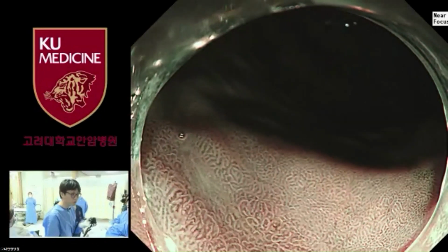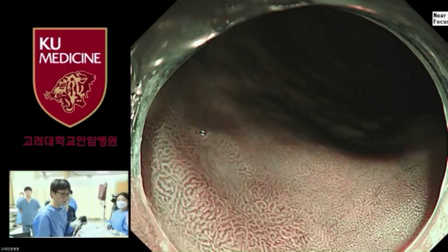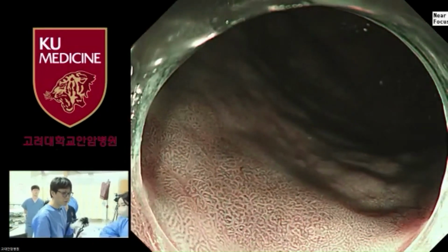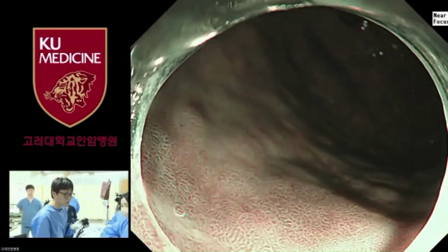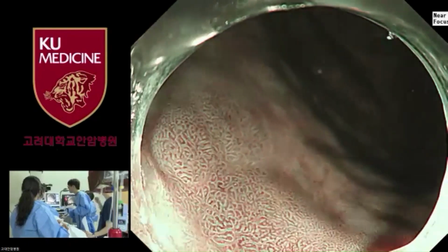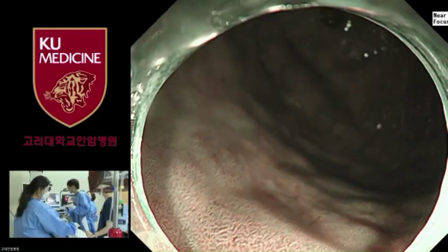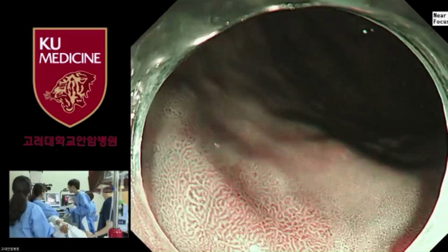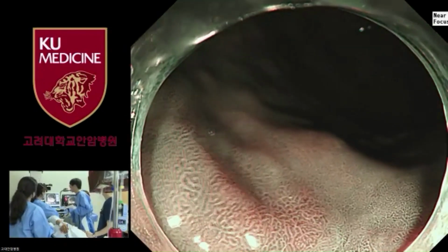So if we describe this lesion by microsurface pattern plus microvascular architecture, you can see the microvascular pattern has a little bit dilated caliber, and the surface pattern is tubular, and here some oval shape. So I think that this is compatible with low-grade dysplasia. And now I'm going to start the marking process.